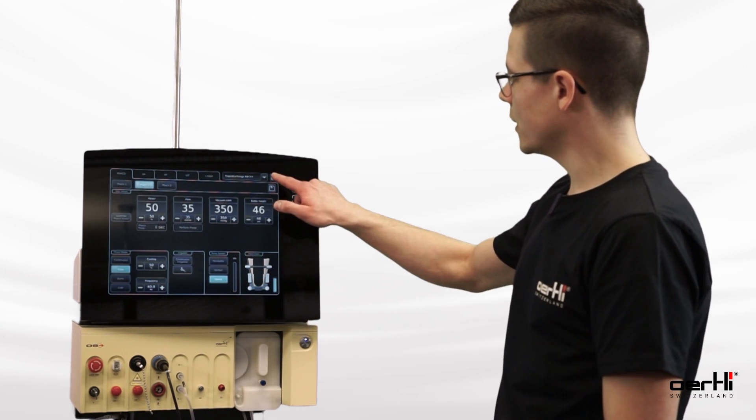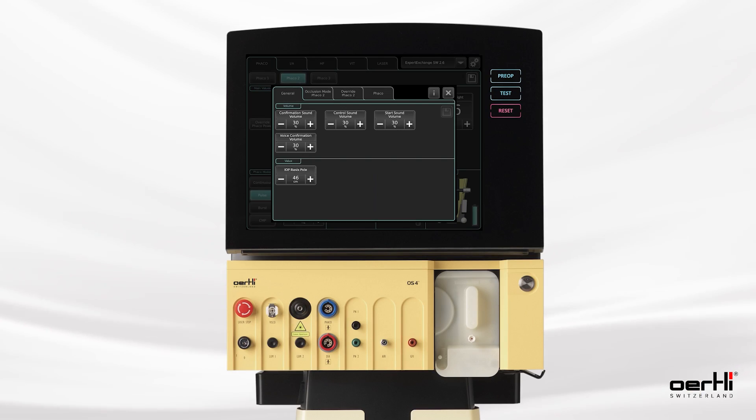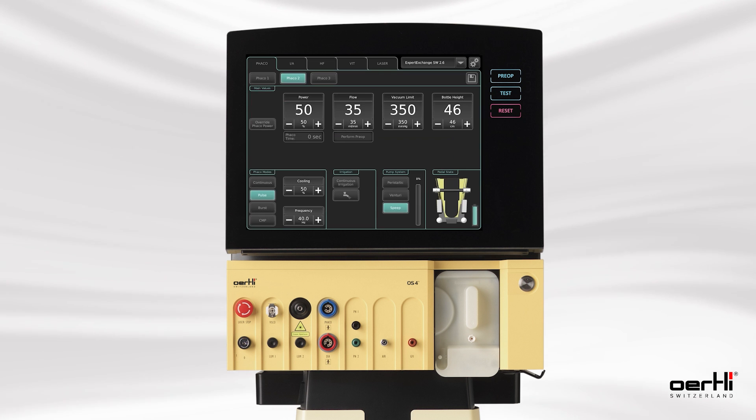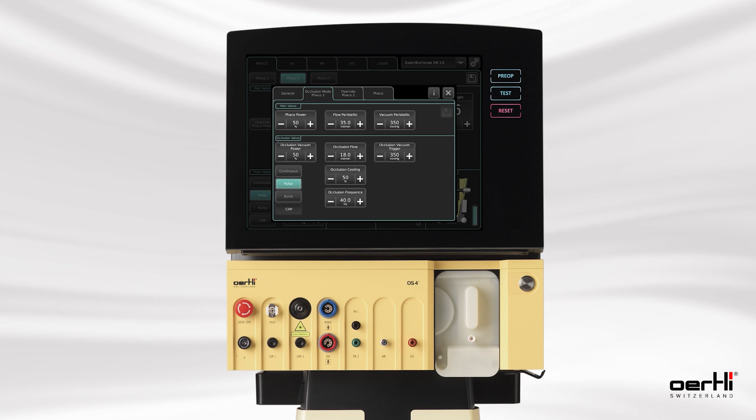To do so, we open the AUX menu, and here we now see with the new software: occlusion mode. The occlusion mode — very important to know — is available only with the peristaltic pump system. So if I want to use it, I have to choose the peristaltic pump system and then open the AUX menu again. By doing so, I now see that I can configure the values for the occlusion mode.